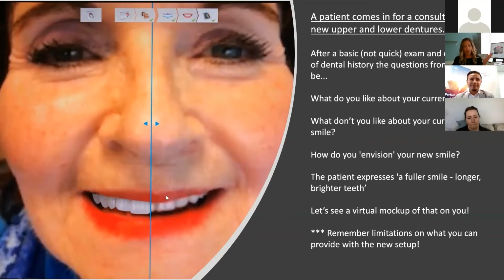So this was a no-brainer. She's like, great, when can we start? And the success rate that you have, if you can convey your thoughts to a patient and they can see it, it's a no-brainer. They say yes.